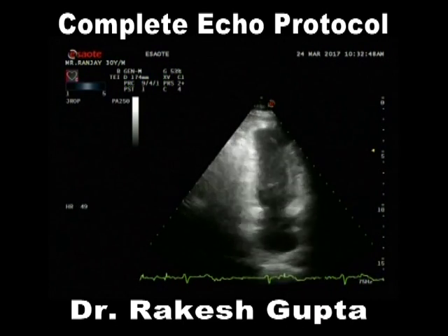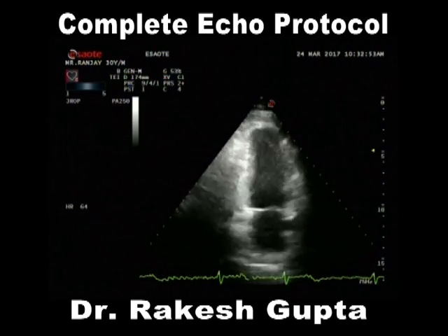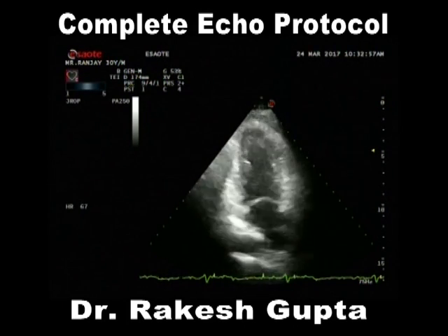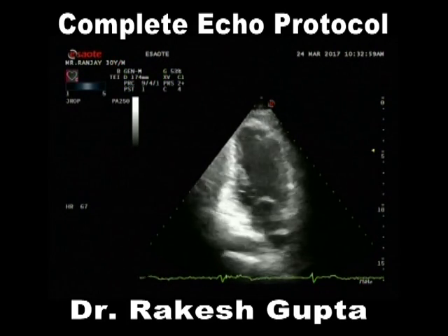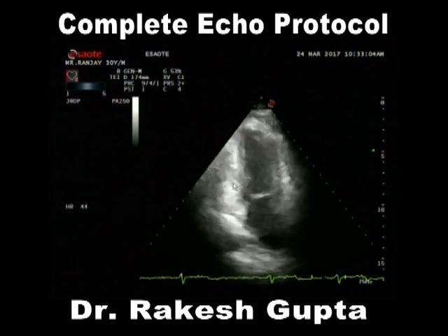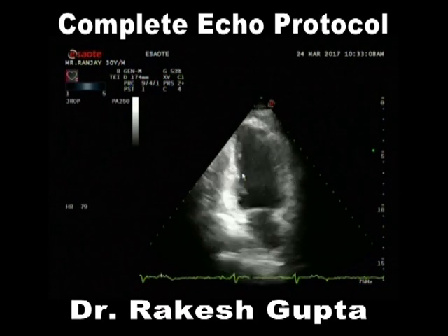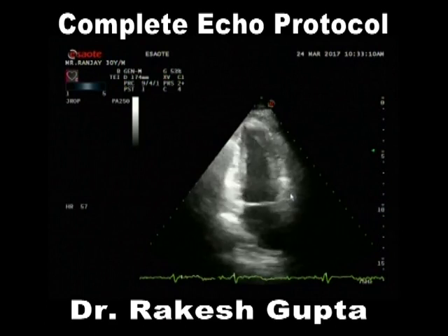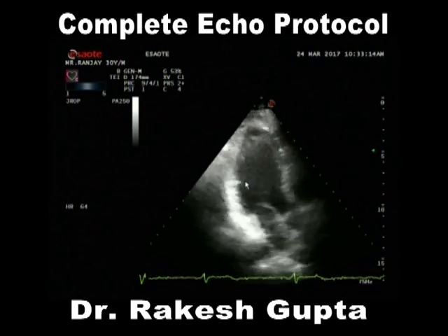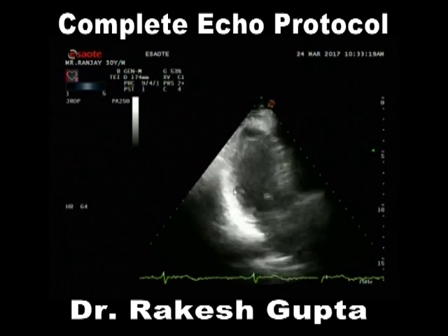Anterior wall does not have any papillary muscles. Look how good the imaging quality has become with the help of inspiration. I can see the whole of the anterior wall, and the whole of the inferior wall. Mid and basal inferior is contributed by RCA and the rest of the segments by LAD. When we rotate counterclockwise, the papillary muscles disappear, this becomes the anterior septum and this becomes the inferior, posterior wall.